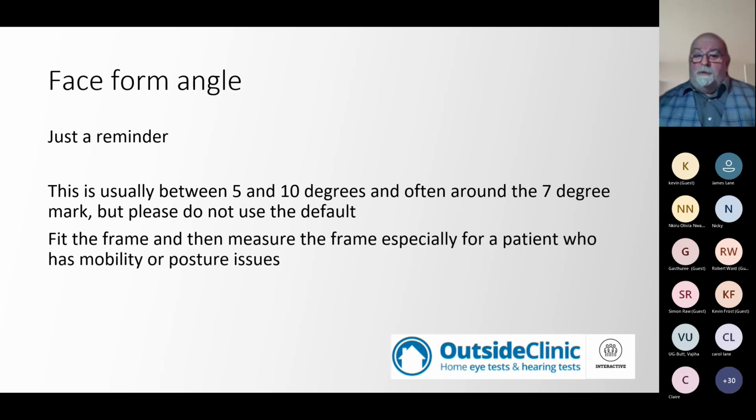Now, the way I do this is I do not try and measure it on the patient, even if I'm in a situation where I'm in the clinic and we've got young, active patients. I don't measure it on the patient, because it's very difficult to do, and you've got to be in exactly the right position. So what I do is I fit the frame, then I let the patient put the frame on so I can recheck the frame.